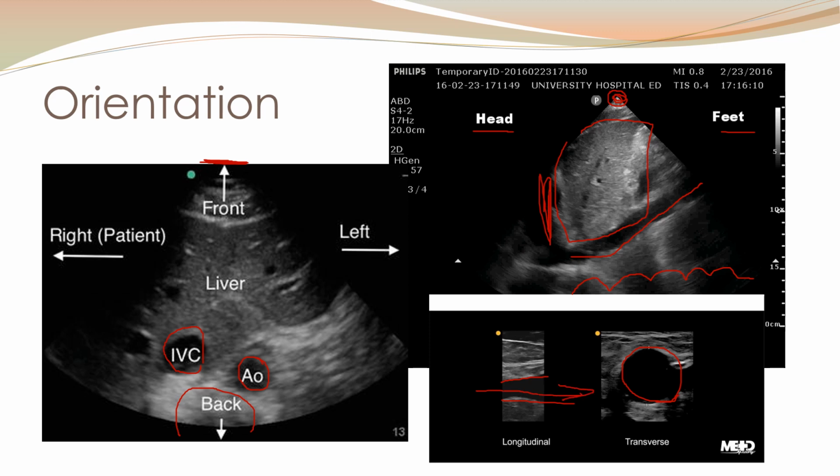This is looking up the hose from the bottom end. Now, since a lot of what physicians and practitioners are going to be doing is needle placement or venous or arterial access, this can be really helpful. One certain note about trying to scan these vessels, we always recommend that you do any sort of vascular or especially venous compression in transverse, because you'd be able to see the whole vessel in there, compress it right before your eyes.